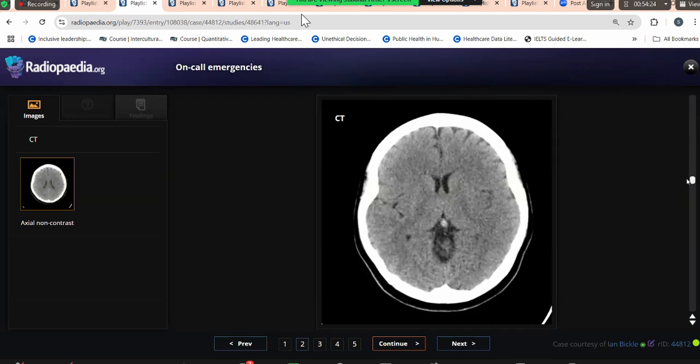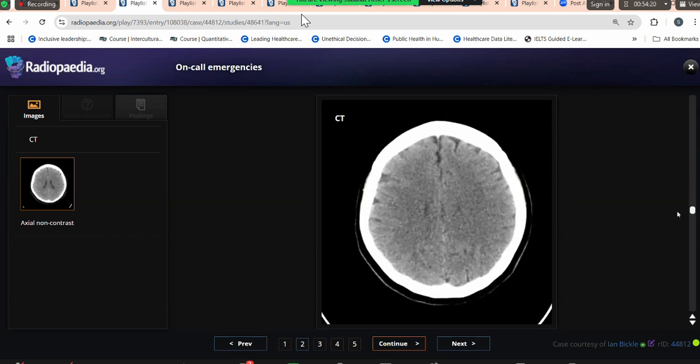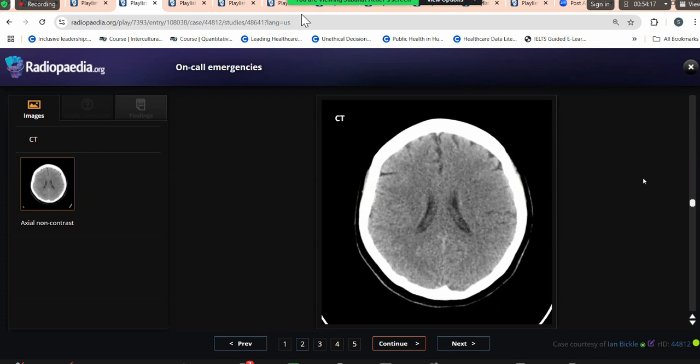So what will you write in the report if you cannot find any acute finding? If there is no acute finding and the patient has presented with right-sided symptoms, then I would ask for MR with DWI imaging, or a brain CT scan with perfusion study could be done to see if there is any evolving ischemia which is causing symptoms on the right side of the patient.